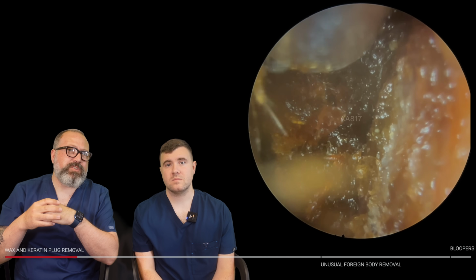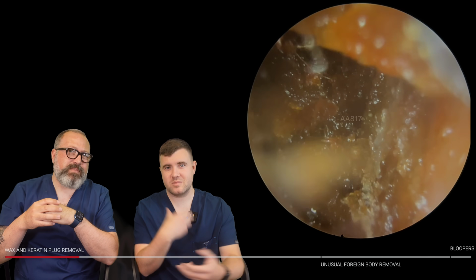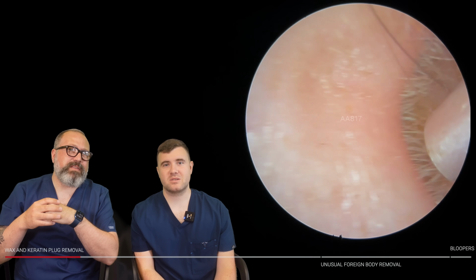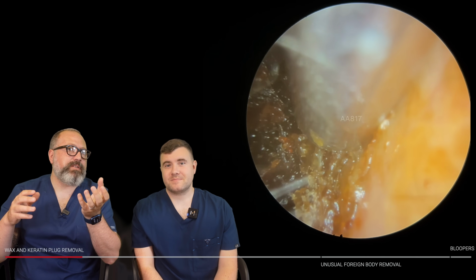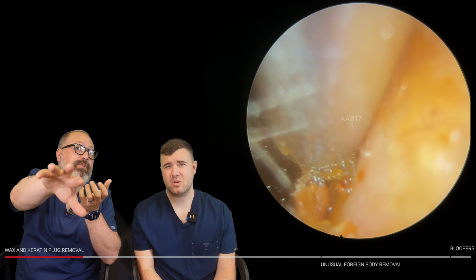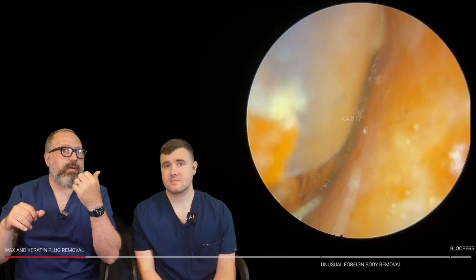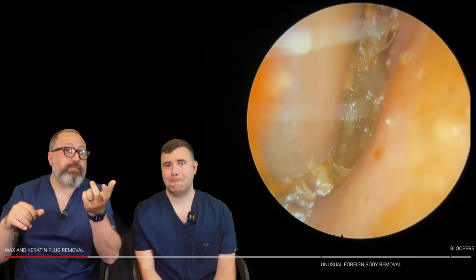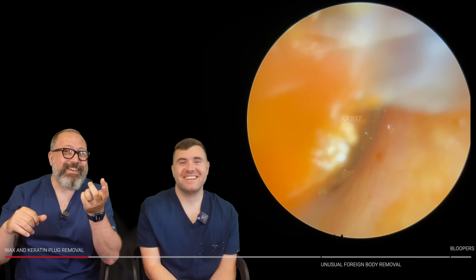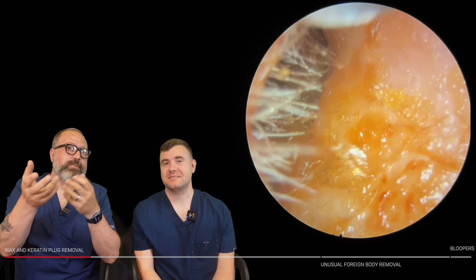You can see I'm just hovering over. You should see it slowly drawing these little bits away, but it's obviously coming away in little pieces. Yeah, and that is frustrating. We were saying for a patient, we can see that keratin layer coming away there. We were talking about, I forgot, my train of thought's gone now. Oh, we were talking about suction tubes. That's what it was. Sorry. When you suction some of these waxes in, they block the suction tube really quickly, and that's what happens here.